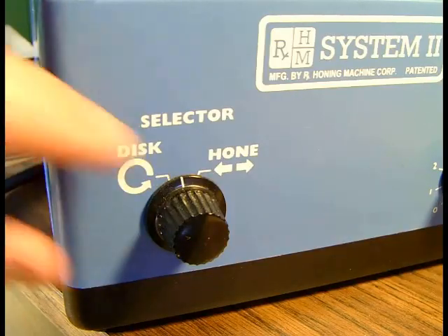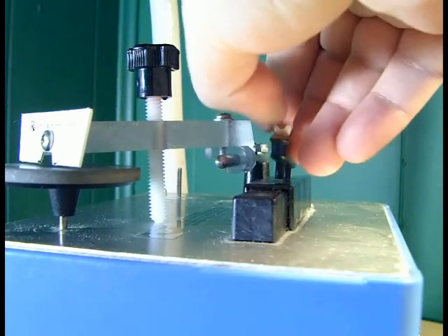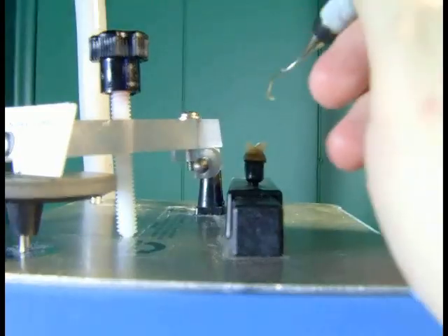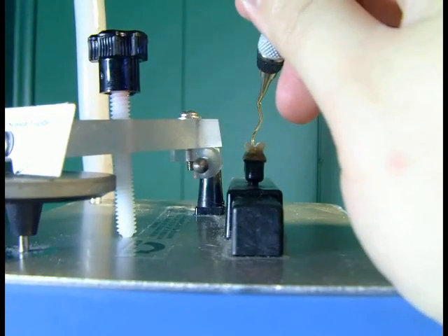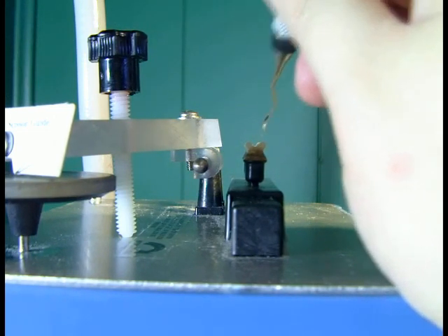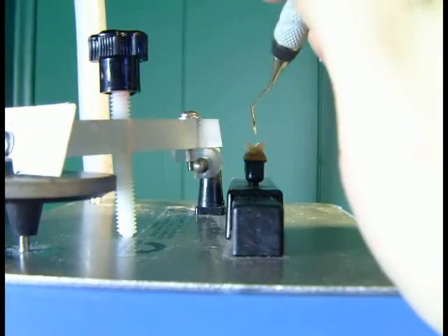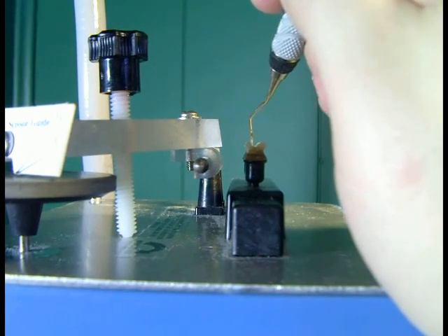The first thing we are going to do to round out the tip is to change the selector from disc to hone. Then apply the hone to the back of the machine. Put the instrument on the hone like so, but with a slight tilt to the back to allow you to put a bevel on the back of that rounded piece. That allows that piece not only to become rounded, but to become sharp, and then move it from side to side.